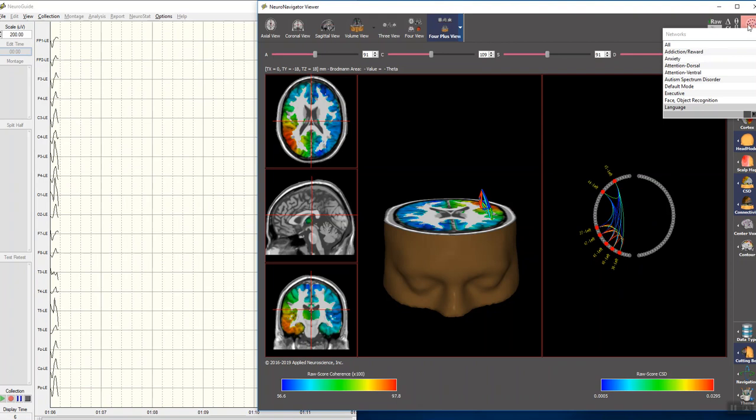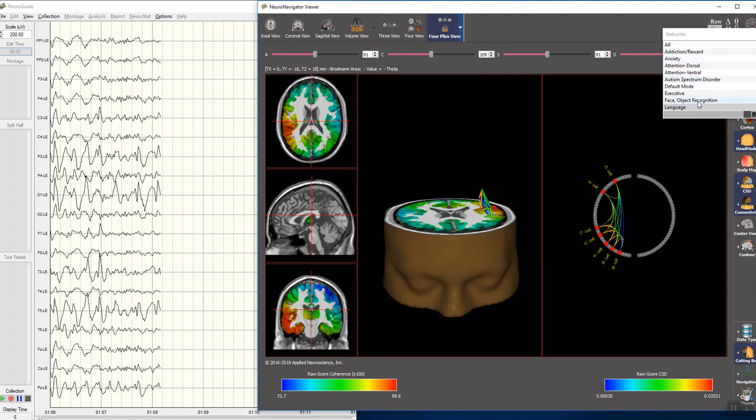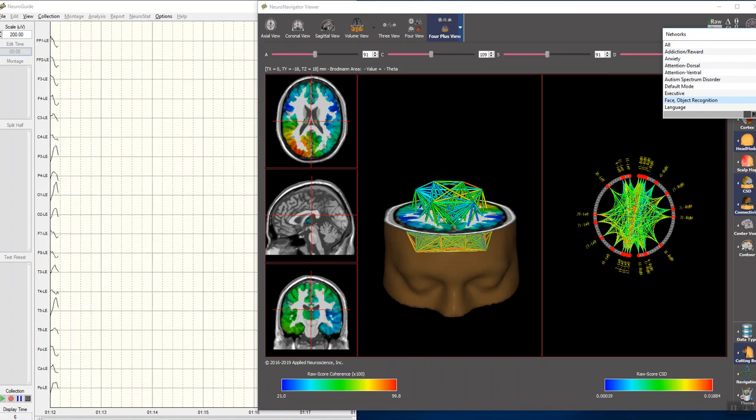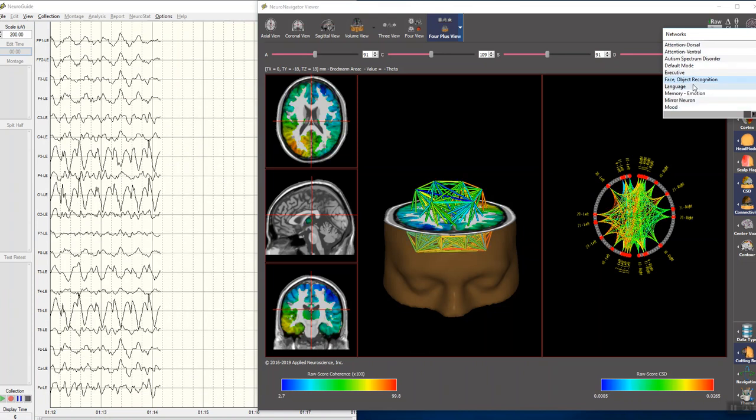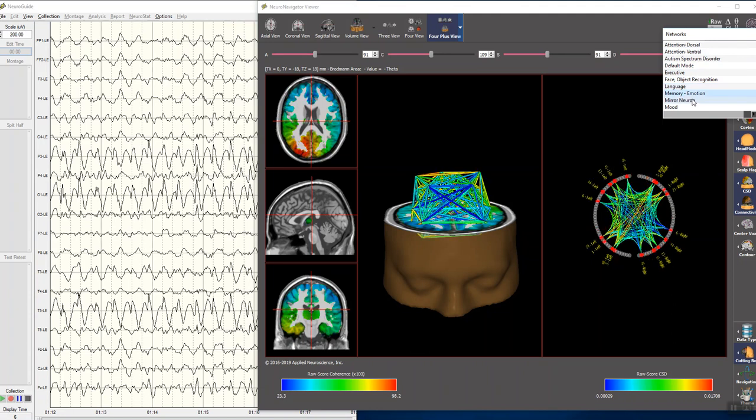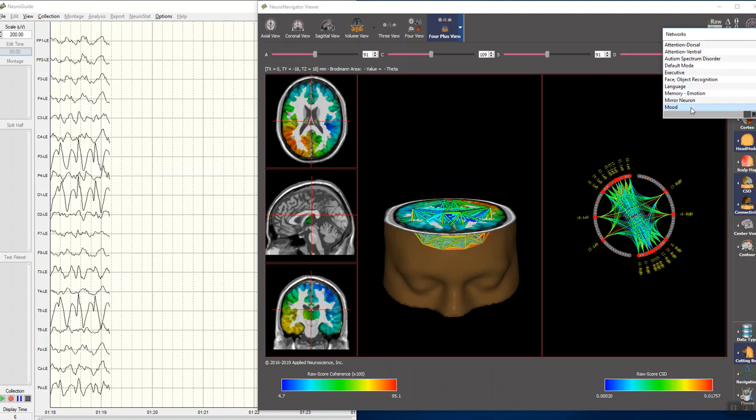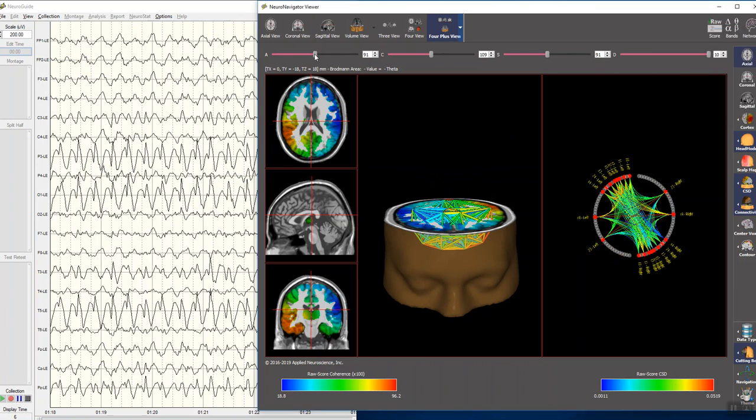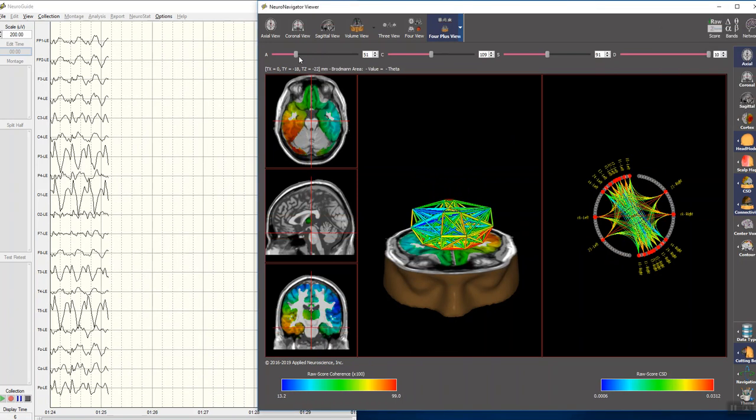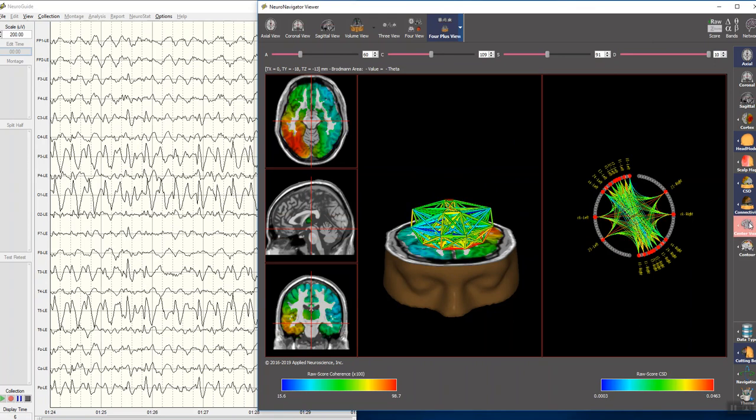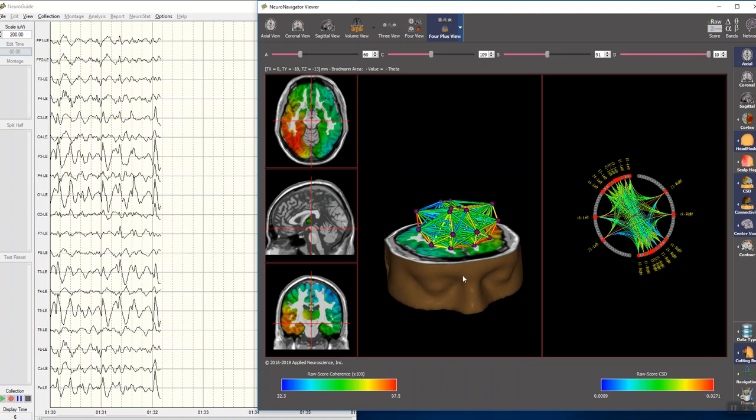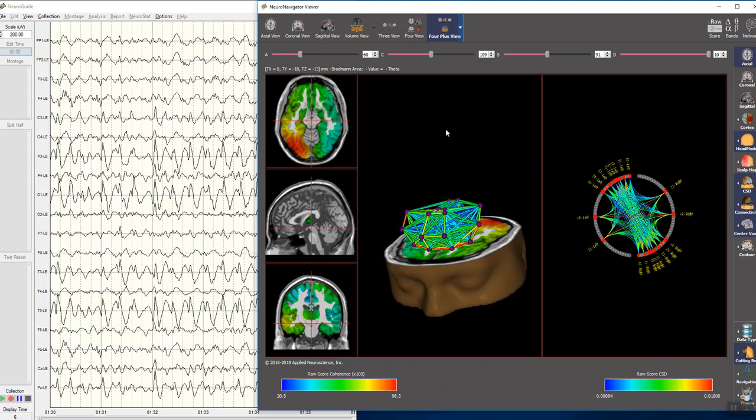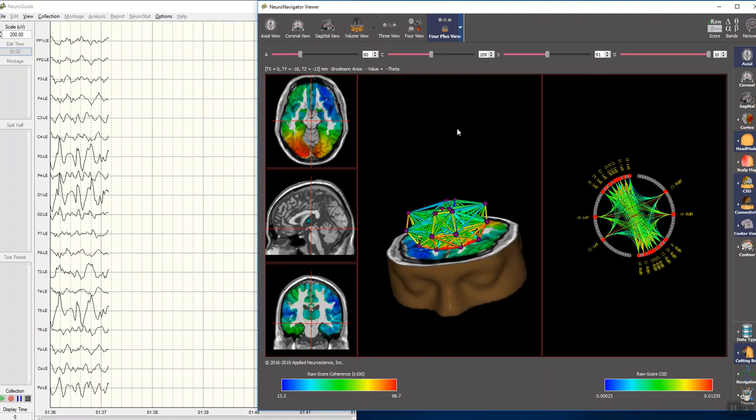And of course, we can then go to a number of different networks. Here's face recognition, memory, mirror neuron, mood or depression network, which allows us to visualize these networks in different ways. We can add the center voxels to the Brodmann areas here. And we can identify each of these Brodmann areas if we wish. This is available in other videos.